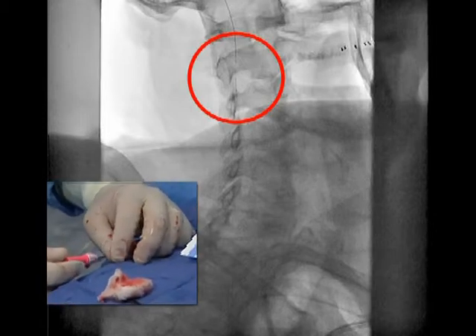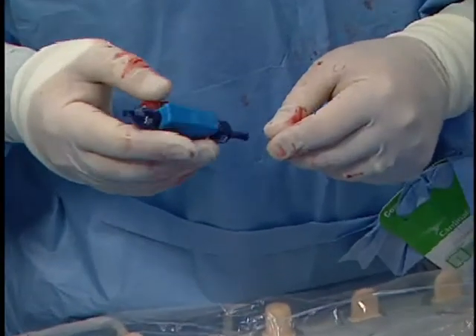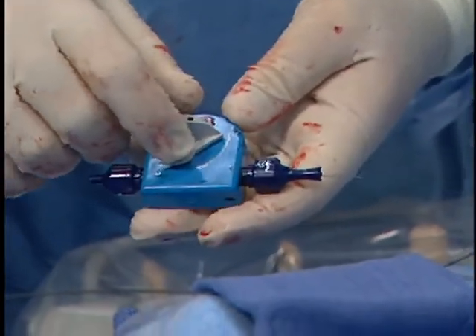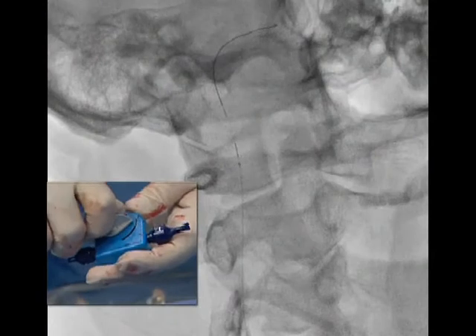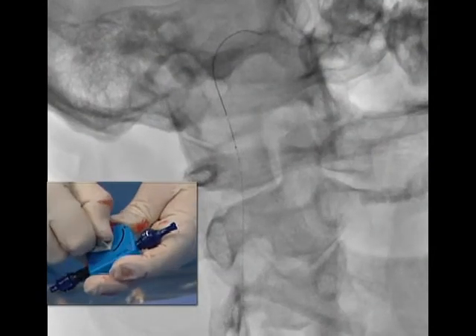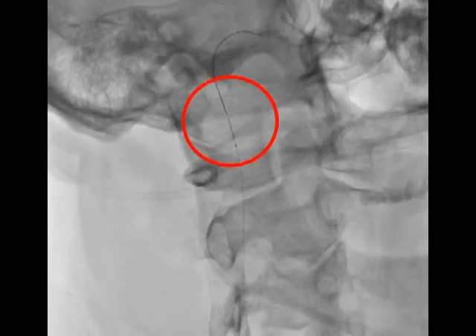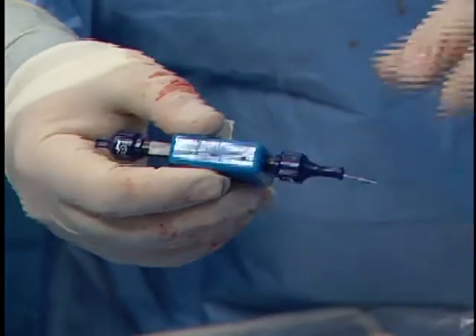We're across the lesion. You can see the Fibernet is advanced up there. This is just going to turn until it locks in, and on the cine film you can see that the distal markers are going to come together — they slide together and that clicks. Now the filter is deployed. This is up near the petrous portion of the carotid, which is a nice place to park the filter. So now I'm going to loosen this back up and remove that, set it aside for retrieval, and it's ready to go.